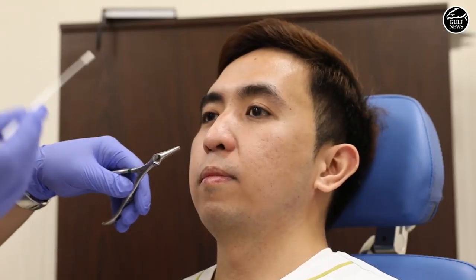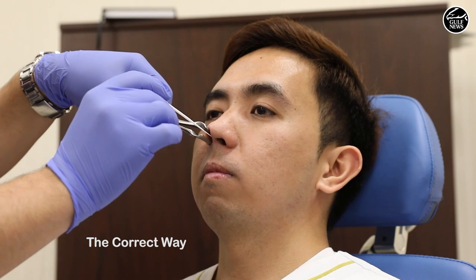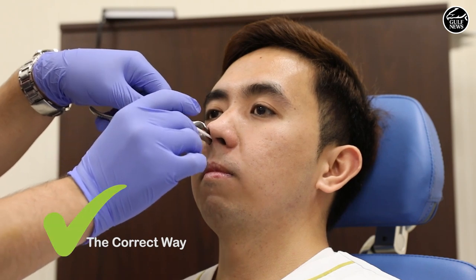This is the Q-tip for specimen taking and the direction has to be — I'm privileged to be having a nasal speculum. The nasal speculum will allow me to see the front of the septum and then the floor of the nose. This swab should be going right along the nasal septum, along the floor, all the way to the back. You turn it when you reach the nasopharynx — you turn it to get a better sample and then you go up. This is the proper way of doing it.